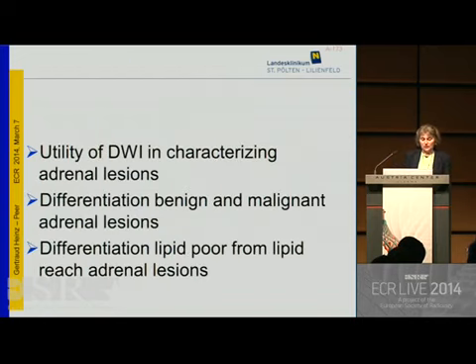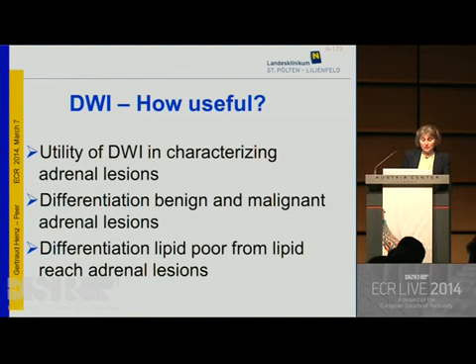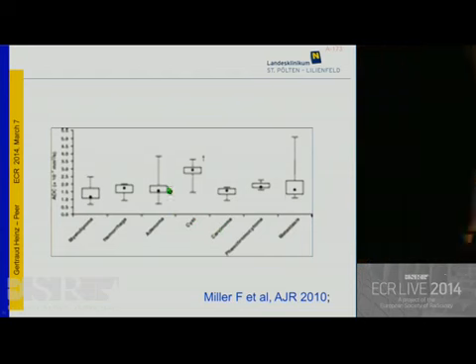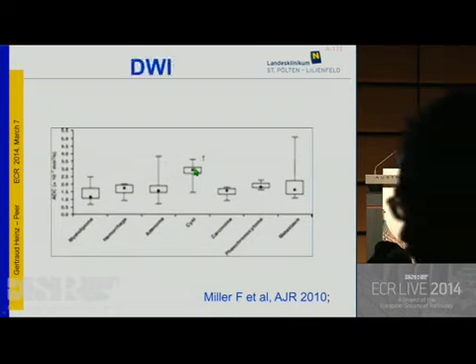What about diffusion-weighted imaging? Can diffusion-weighted imaging on MRI be helpful in characterizing adrenal lesions? It has been shown by a major study of Miller and co-workers that unfortunately DWI is not very helpful in characterizing adrenal lesions except for adrenal cysts.